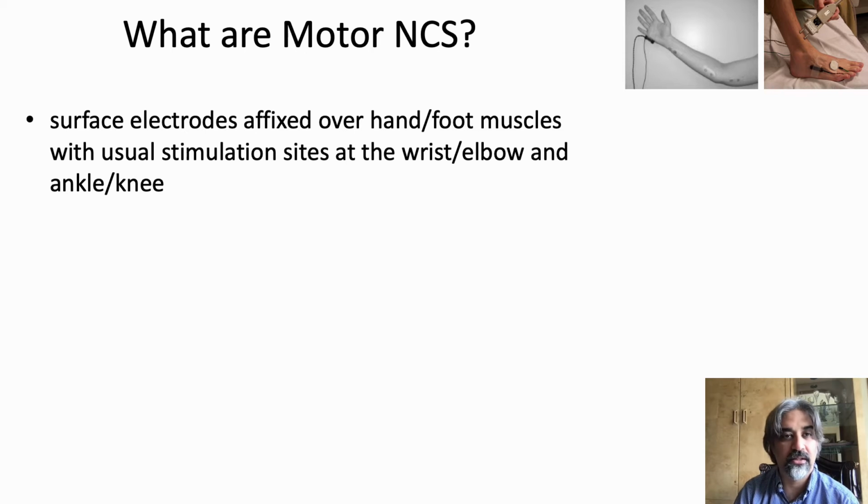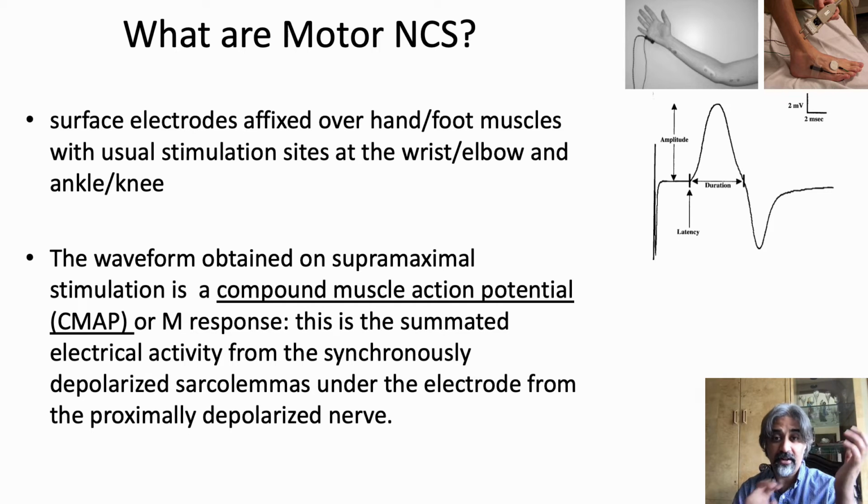Motor nerve conduction studies are performed somewhat similarly to sensory studies. Here we attach an active surface electrode over the motor point and a reference somewhere nearby to cancel out noise. The motor point is essentially just the mid portion of the muscle belly where the neuromuscular junctions are purported to be located. This is typically done over the hand or foot, but can be done anywhere including more proximal limbs, face, or trunk. After delivering an exogenous current via surface electrodes through the stimulator wand, the action potentials will propagate down the nerve to the neuromuscular junction.